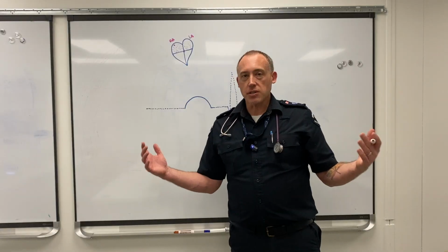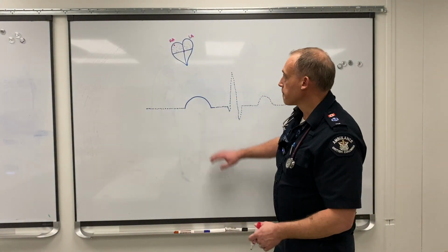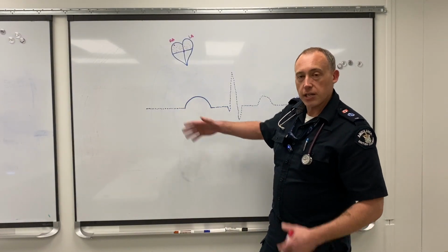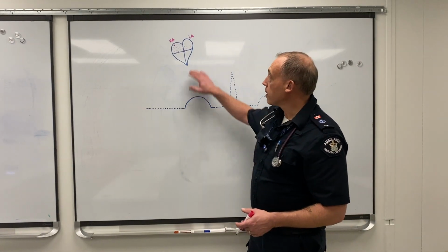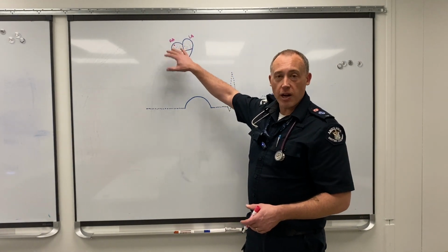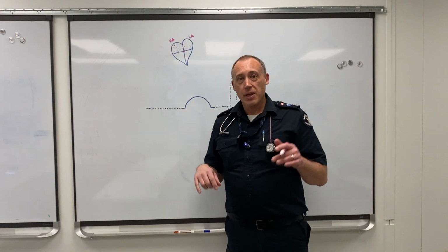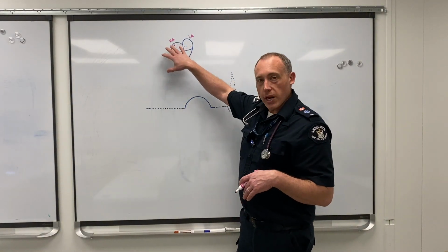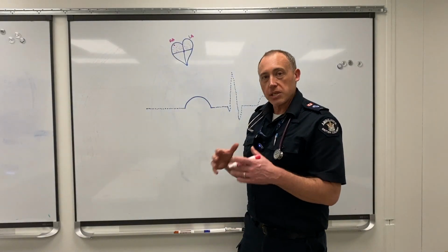Learning about ECGs is kind of pointless if you're not going to relate it to what you're seeing in your patient. Now, when we look here, we can see some variations on the P wave in certain cases. What's going to cause those variations? For the most part, it's going to be different degrees of how messed up your atria are. And the way that atria get messed up is if they get bigger. So I can have an enlarged right atria where the muscle mass gets bigger, or an enlarged left atria where the muscle mass gets bigger.